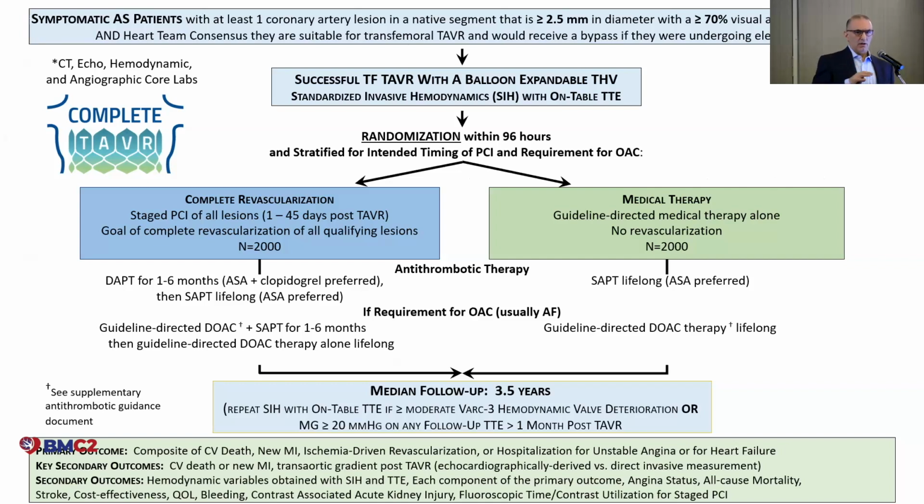Now, there's always some subtle hidden politics in this. We all know that it's more difficult to do PCI through the cage of a CoreValve. So the fact that they do this 1 to 45 days post gives benefit. It is an Edwards-driven type of study because it's easier to do PCI post-Edwards. But it is a very good study in that you see what the strategy is.